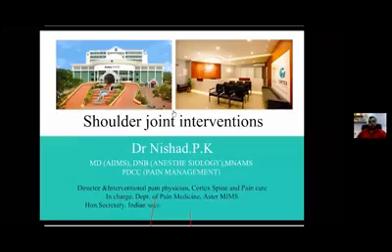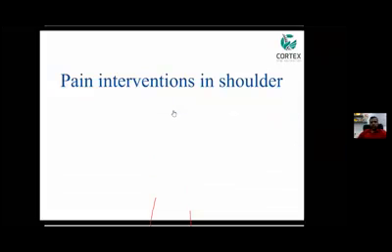The topic is shoulder joint intervention. The advantage of shoulder joint intervention is that if you see the patient in the OPD, you can immediately take an ultrasound and examine the patient, and we can do the intervention there itself in the OPD. That is the advantage with the shoulder joint.